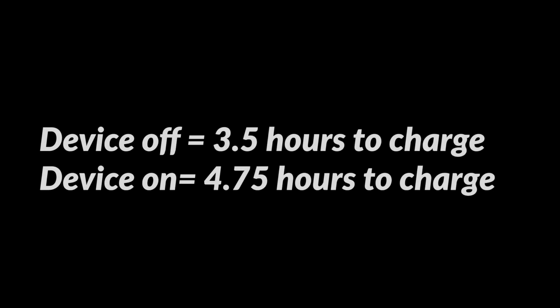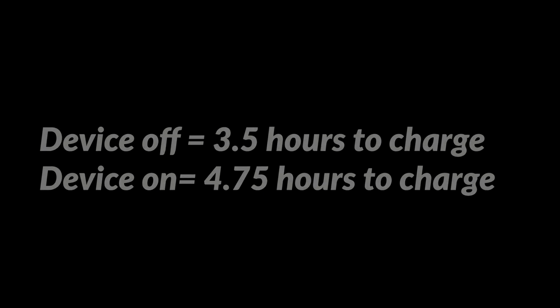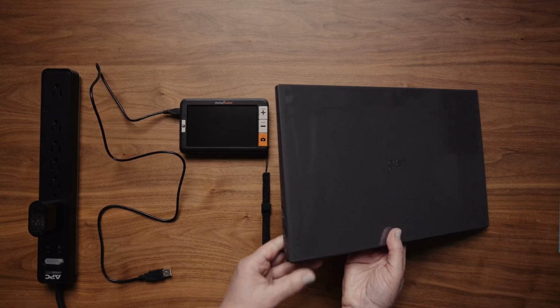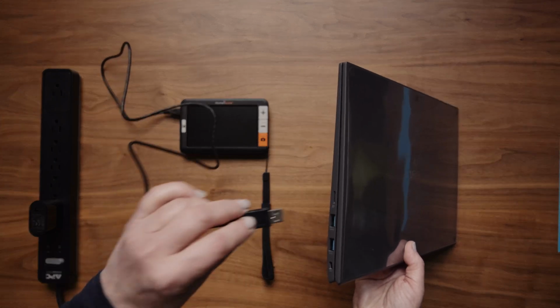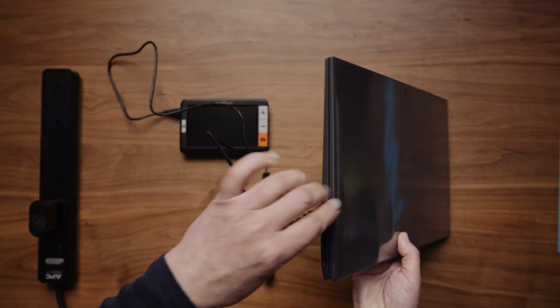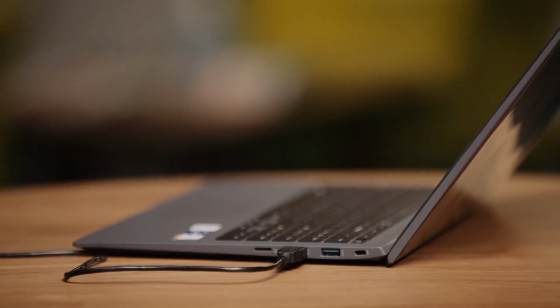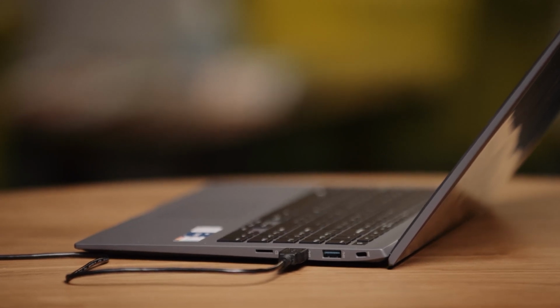It should take approximately 3.5 hours to recharge an empty battery with the device off and 4.75 hours if using the device. A fully charged device has 3 hours of battery life if used continuously. It is also possible to use a computer to charge your device. Simply connect the USB cable to a computer instead of the power adapter brick. The device might take longer to charge depending on the amount of power supplied by the computer.